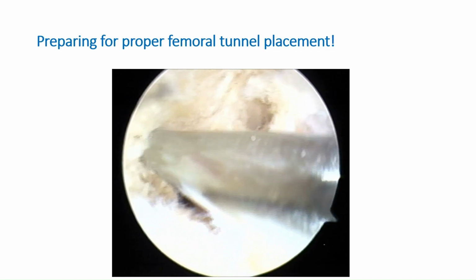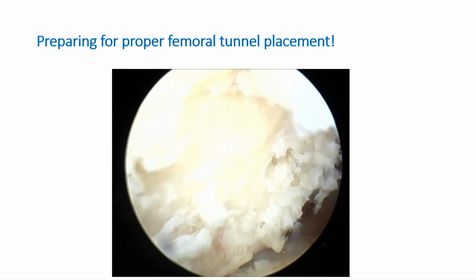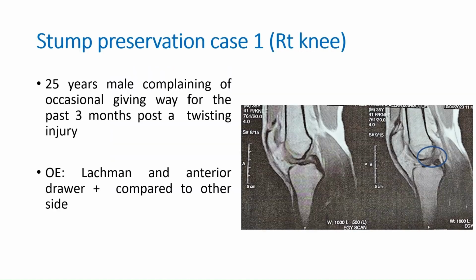This is what we used to do, but we are removing too much of the ACL if there was still residual connections to the femur, and we are losing the collagen fill on the femoral side. So let's go to this case. Again, it's a right knee.